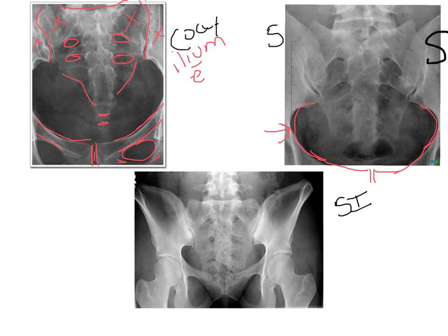This pelvic brim is important because it also gives us an indication of rotation. Do we have equidistant sides from the lateral borders of the pelvic brim and the sacrum? Now, the coccyx you will probably not be able to see because it will be, or should be, superimposed by the pubis symphysis. Of course, you have your pubis bones here. We're not seeing those clearly in here, but we see them over here on the coccyx.